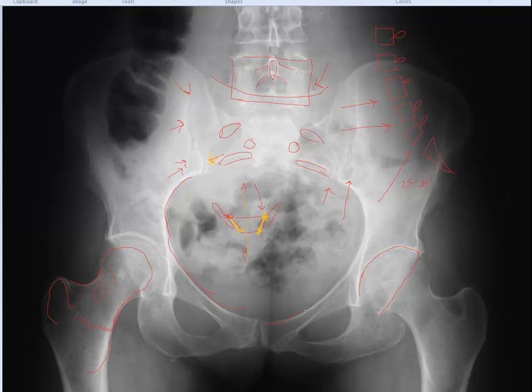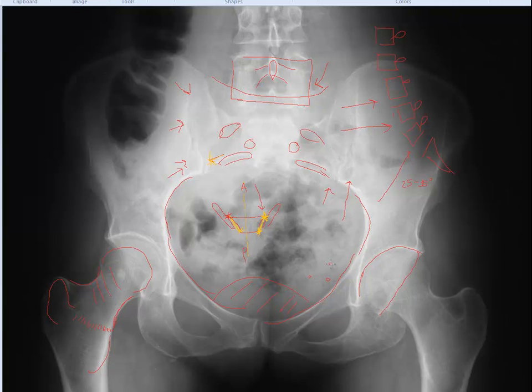You should have none of the femoral acetabular joint visualized within the pelvic inlet or any other conspicuous structures. If the patient's bladder is full, sometimes you can see slight opacity to the pelvic floor in the region of the bladder. Also, small concretions may be seen — if you see little small round calcifications, these are typically phleboliths. PHLEB pertains to the venous system, and these are small calcifications in the pelvic venous plexus, which are incidental findings. I think we have covered all of our anatomy, and I hope this tutorial was very useful for you.